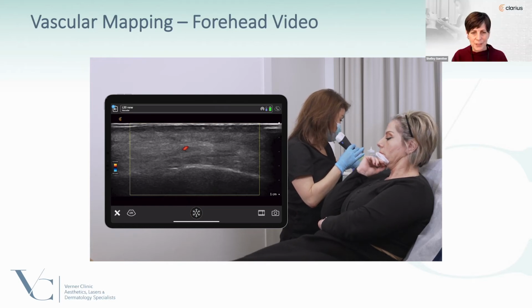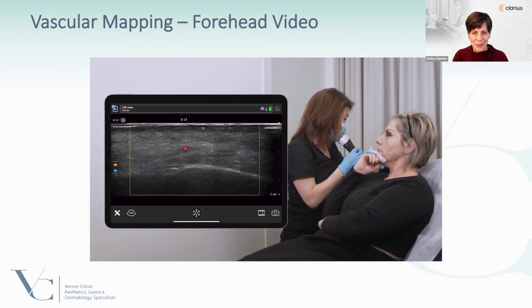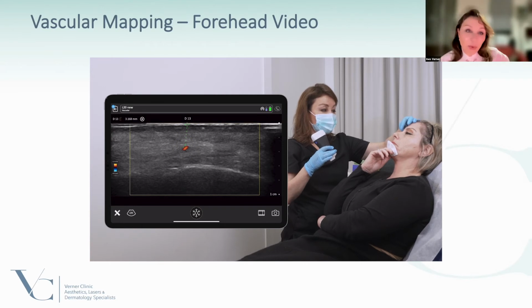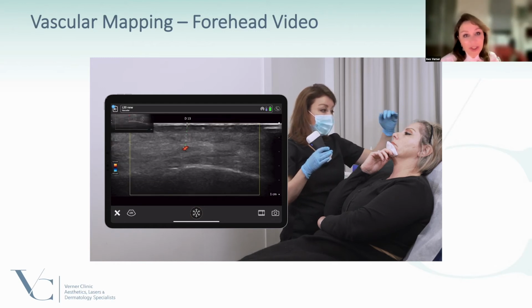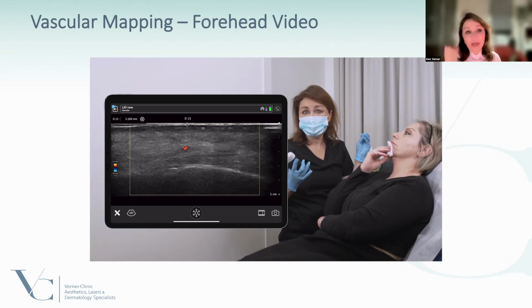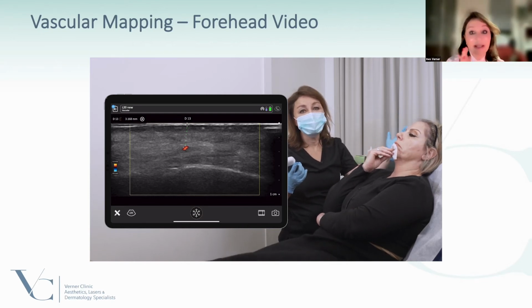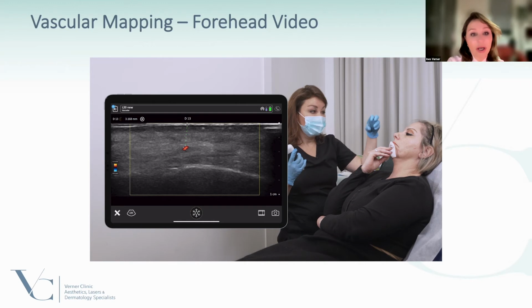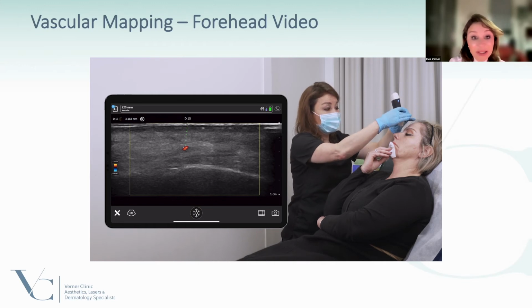Yeah, it's incredibly superficial. I would like to ask, now that you use ultrasound, can you imagine living without it? Actually, no. When you start using it, it's really difficult not to use it. Like today, I had a few patients in the clinic, and I'm getting quite fast in it. I did the temporal area in a patient, and also the marionette line. And especially the forehead and the glabella, which are really terribly dangerous, these areas I would always use that, because then you're very safe.